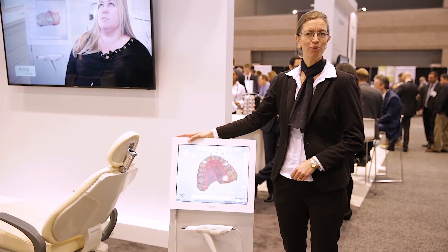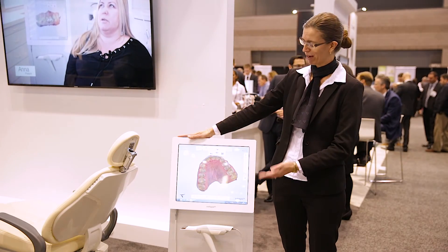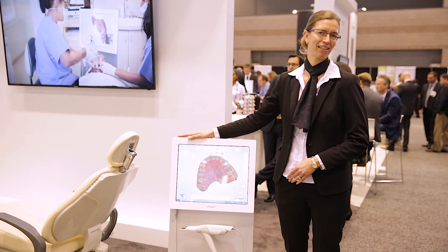Please stop by our booth and we'll be happy to show you the new Trios 3 battery cart. Thank you.